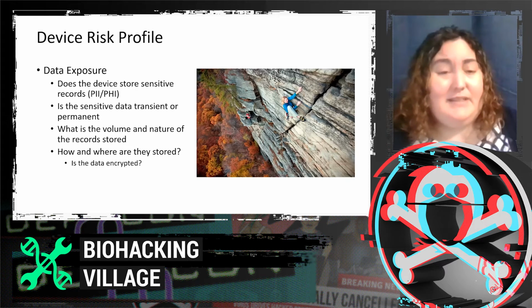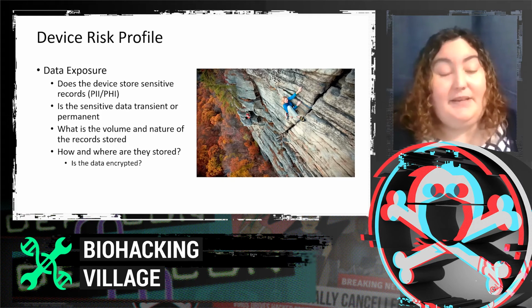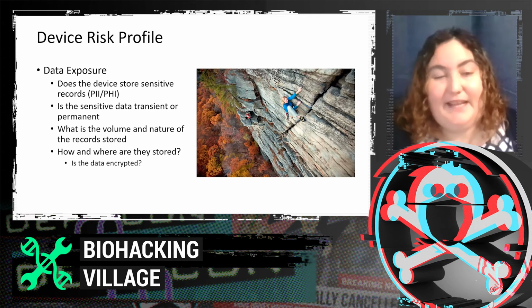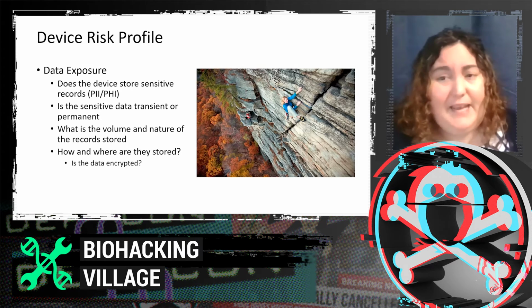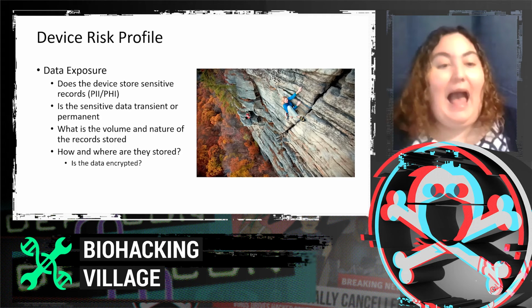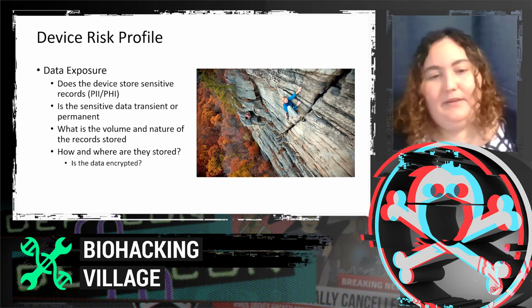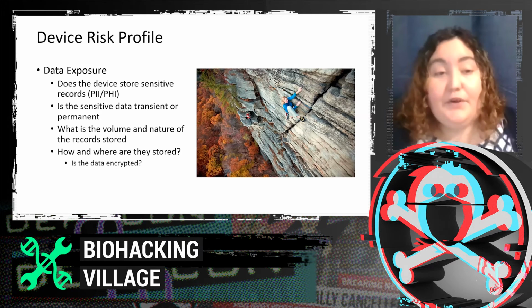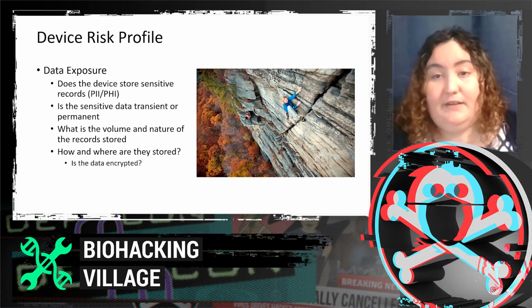Data exposure. Does the device store PHI or PII? Is the sensitive data only stored for a small period of time, or is it permanent? How many records are stored? How is it stored? These are all questions you're going to want to ask your MDM. They are your partners in this.